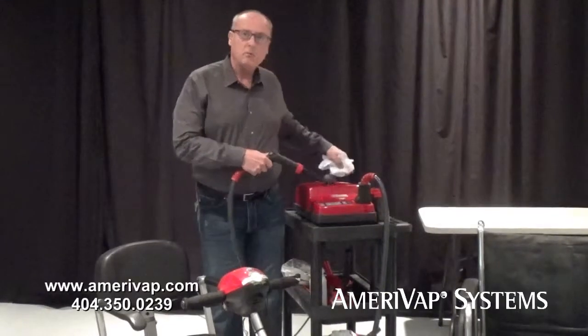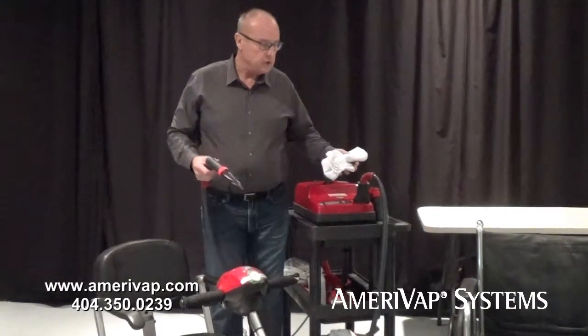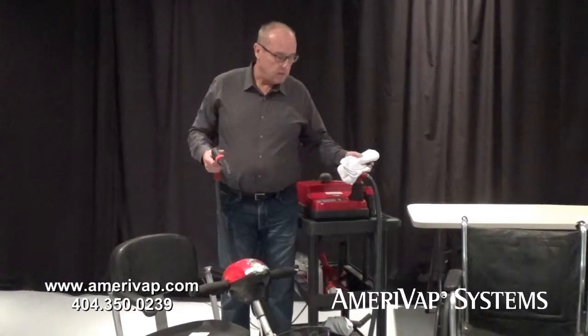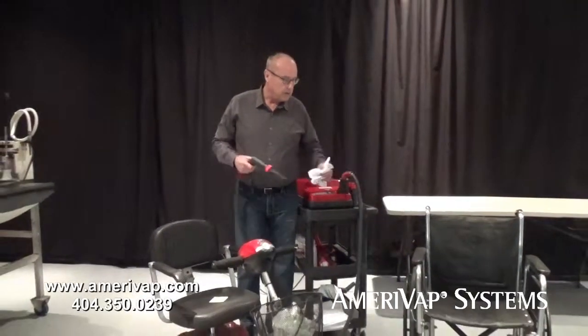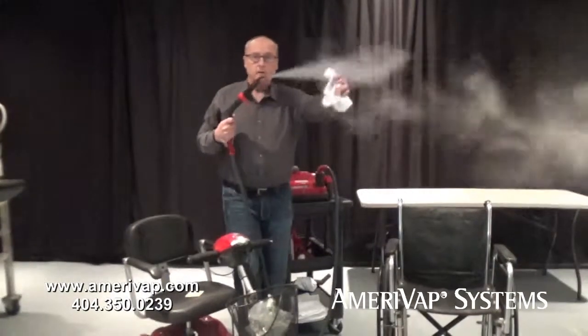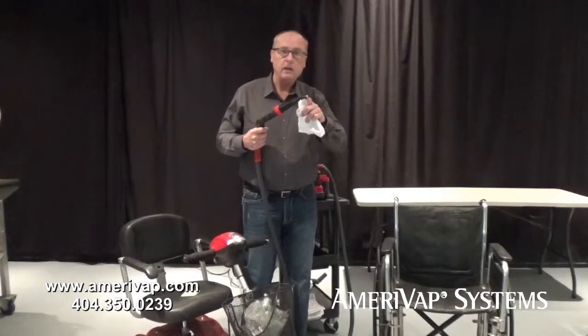Today we're going to take a look at our Vapor Blitz 2, which can be used in any number of applications, including healthcare, medical devices, or medical operations. We're going to show you how the dry vapor steam works. It's very safe to use. All the cleaning is done here — this is where the heat is.